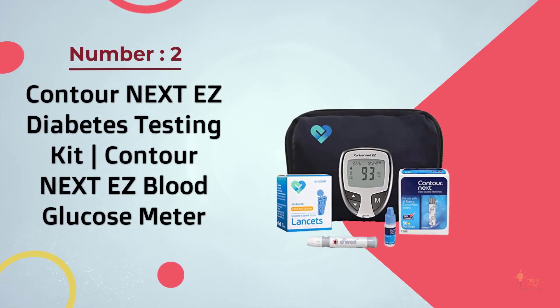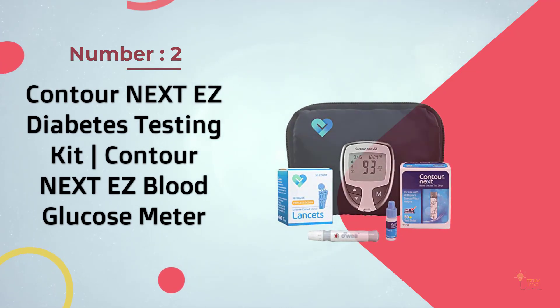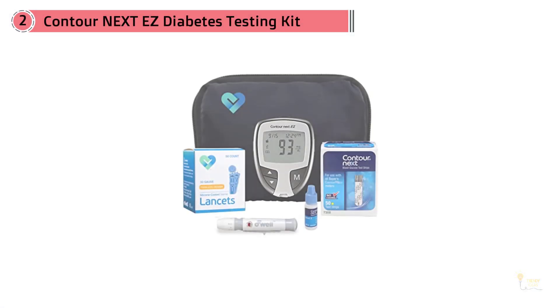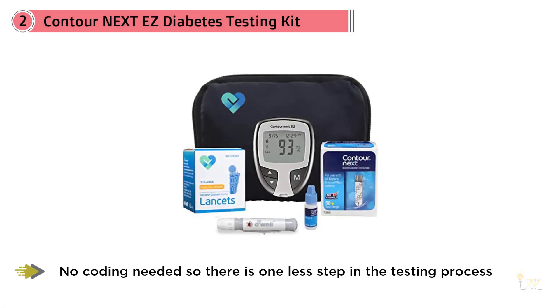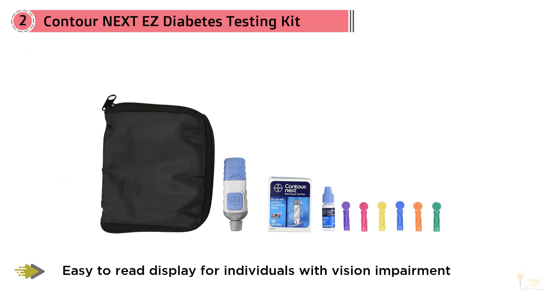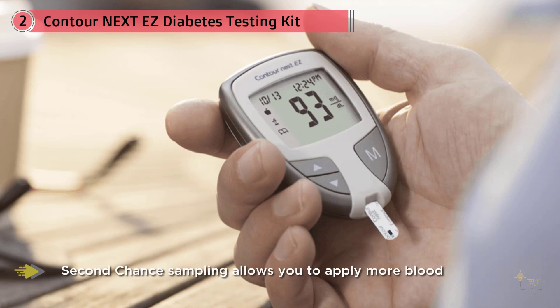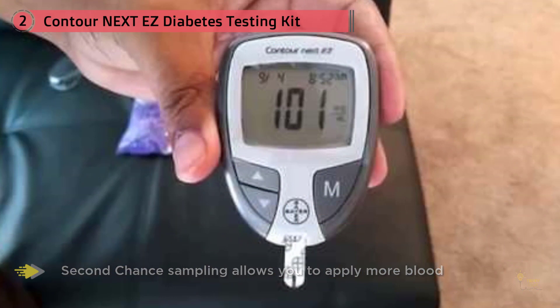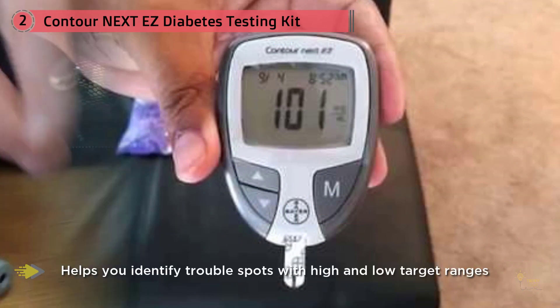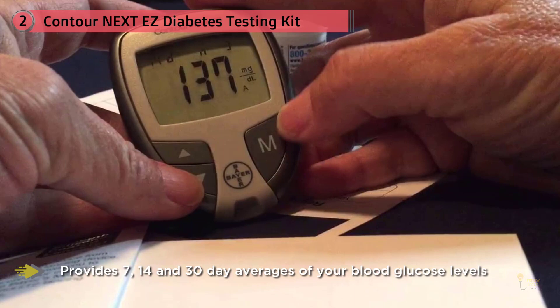Readings are fast, available in just five seconds, and take just a small amount of blood. It runs on a 3-volt lithium battery, which is included. Number two: Contour Next Easy diabetes testing kit, Contour Next Easy blood glucose meter. This is great for people with diabetes or anyone new to blood glucose testing, or those who don't need all the fancy bells and whistles. The display screen is not backlit, so it may be hard to read in poor lighting. The meter fits well in the hand at just over three inches tall and about two inches wide, weighing only 1.7 ounces with batteries installed. The Contour Next Easy is very accurate, using 0.6 microliter samples and running tests six times using multi-pulse technology to ensure the best result.